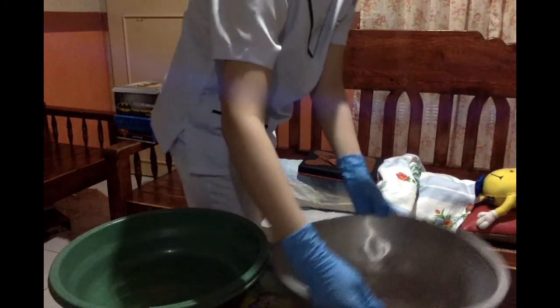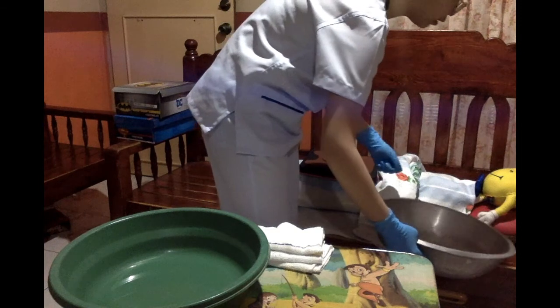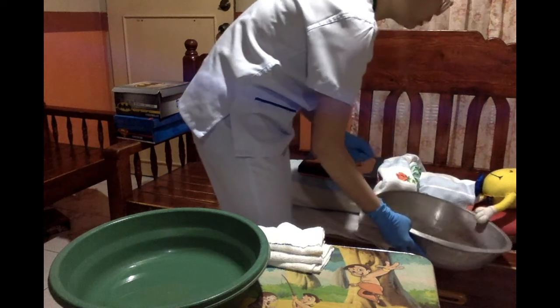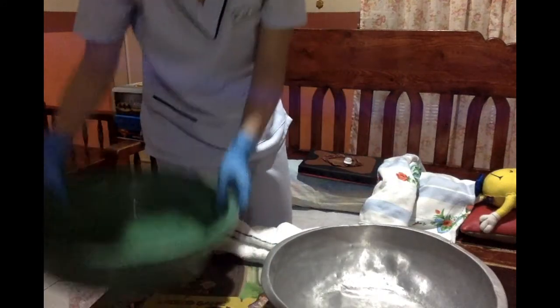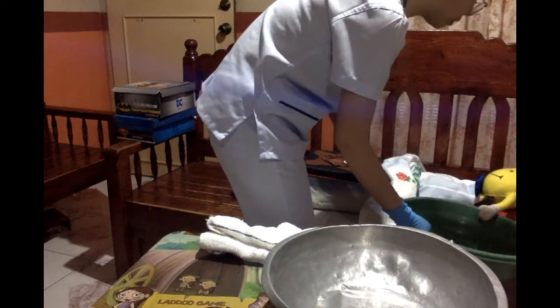Miss Smiley, ano rin po yung kamay niyo dito. And tignan niyo po if okay po sa inyo yung temperature. Hindi naman po masyado mainit at hindi rin po malamig. Maligamgam lang. Ito rin po. Okay naman po.